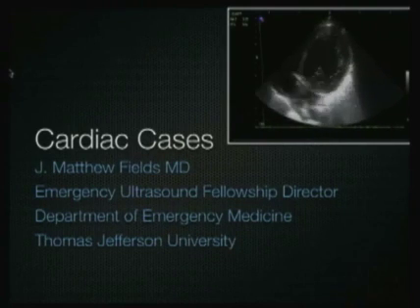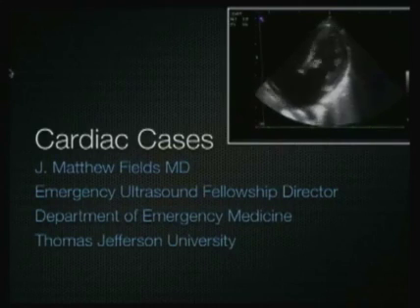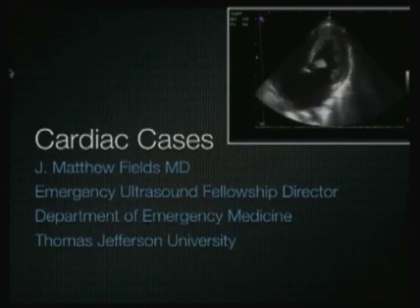And 90% of diagnosis of this is just simply taking a look grossly at the heart, especially for those people new to this. Pathology is sometimes very easy to see and doesn't require too much advanced skills.